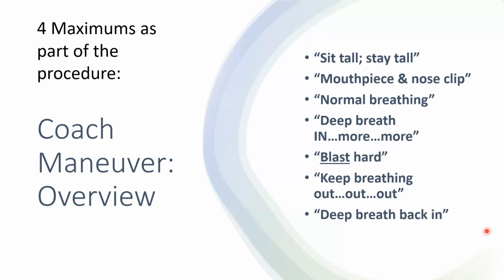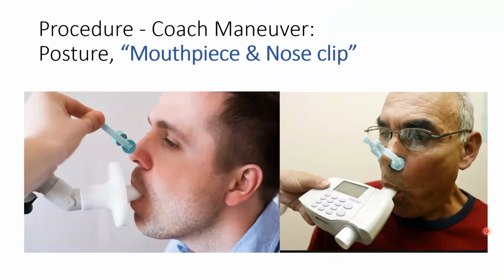After you prepare the patient and instruct and demonstrate, then you want to coach as the patient does the maneuver. Quick synopsis: sit tall, stay tall, mouthpiece and nose clip, normal breathing, deep breath in, more, blast hard. Keep breathing out, out, out, deep breath back in. All right, a little more detail.